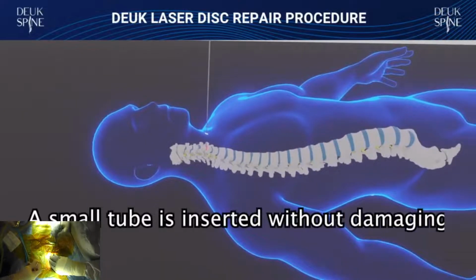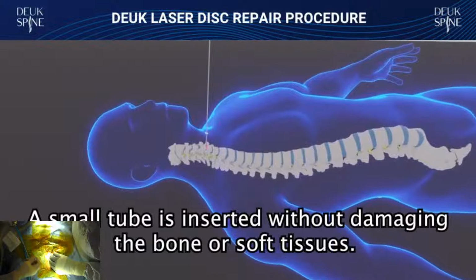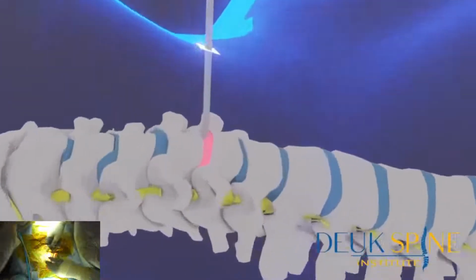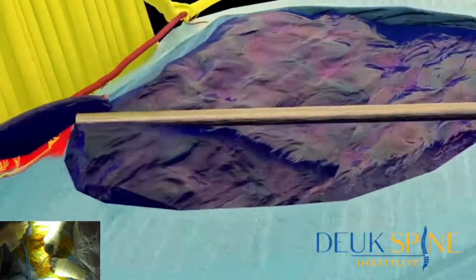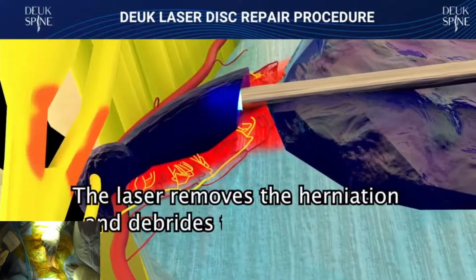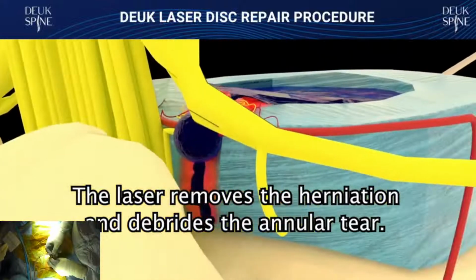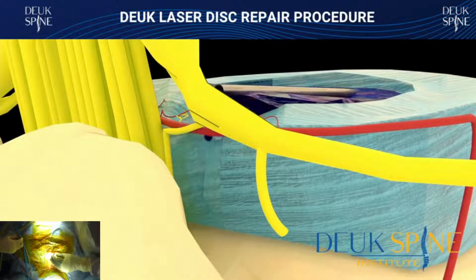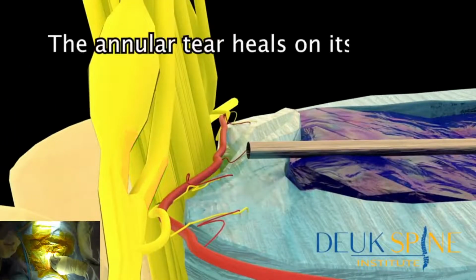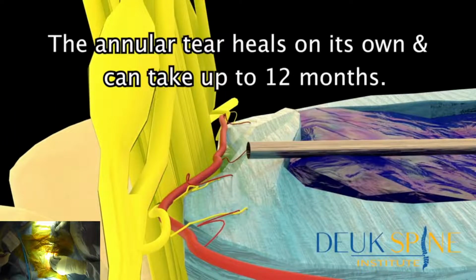A small tube is inserted without damaging the bone or soft tissues. The laser removes the herniation and debrides the annular tear. The annular tear heals on its own and can take up to 12 months.